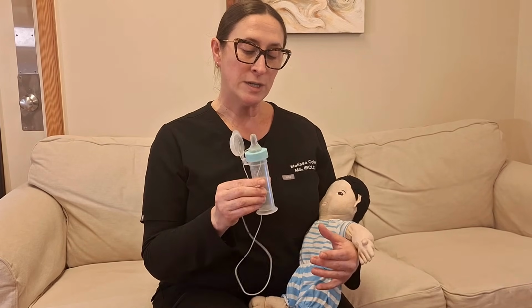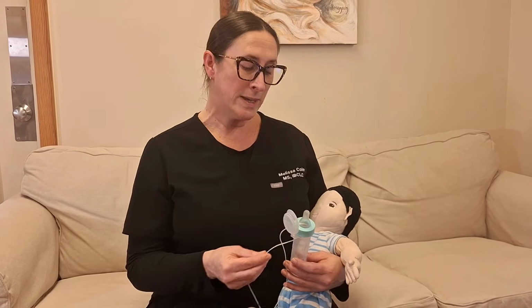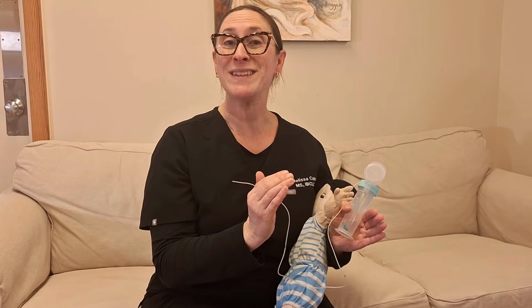There are many reasons a baby may need added flow or supplementation when feeding at the chest or breast. In summary, I find often a do-it-yourself homemade version can be a bit more user-friendly, a little bit more cost-effective than some of the over-the-counter commercial products. That being said, sometimes it does require some extra support to help your baby use this tool. It can often help families that are doing a triple feed, where they're working on breast and latch skills, bottle, then pumping. Sometimes it can take that extra step out where they can get all of their supplementation needs met at the breast.